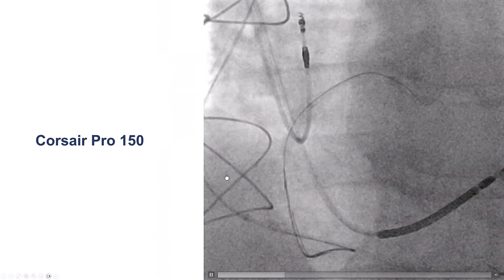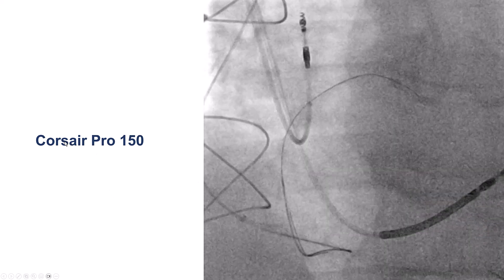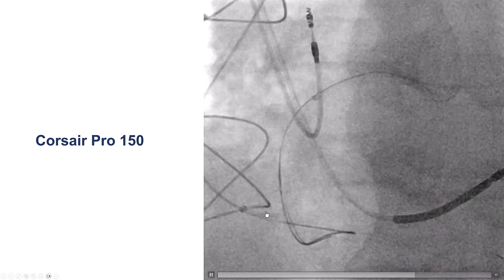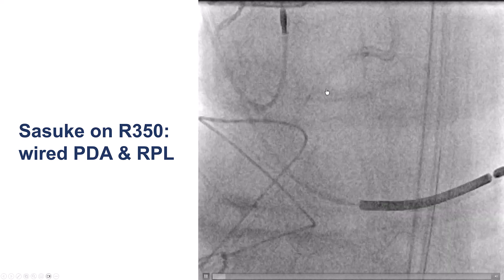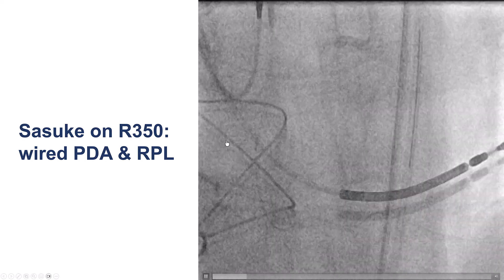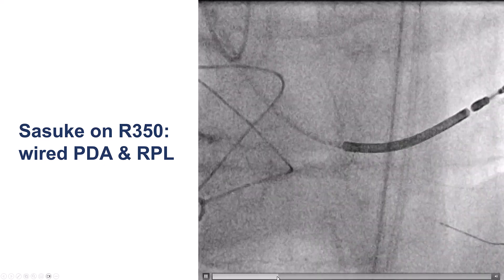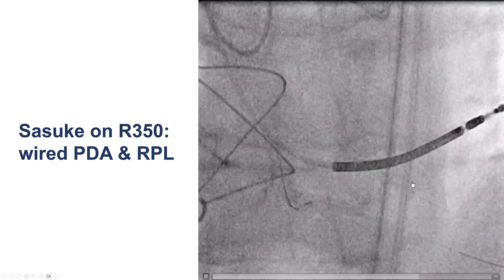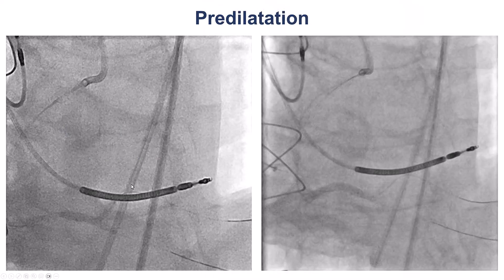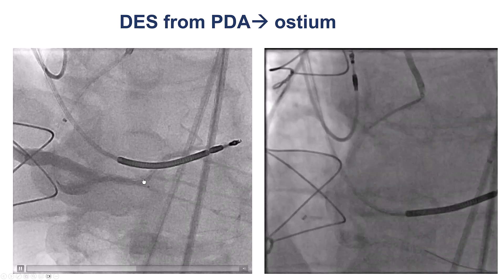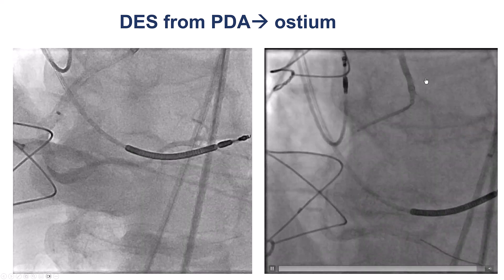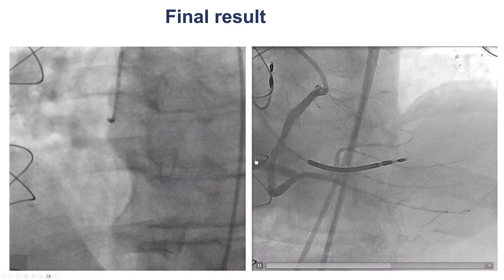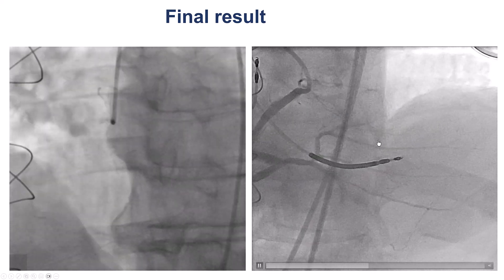After this, we decided to use a microcatheter that is a little larger and more supportive — the Corsair — and repeated the same steps. We went retrograde, advanced the retrograde wire into the antegrade guide catheter, and externalized. We used a dual-lumen microcatheter to successfully advance a guide wire into the posterolateral as well as the PDA. We then predilated both vessels and, after removing the retrograde wire, placed stents all the way from the PDA to the ostium of the right coronary artery, obtaining a nice result with TIMI 3 flow in both the PDA and posterolateral.